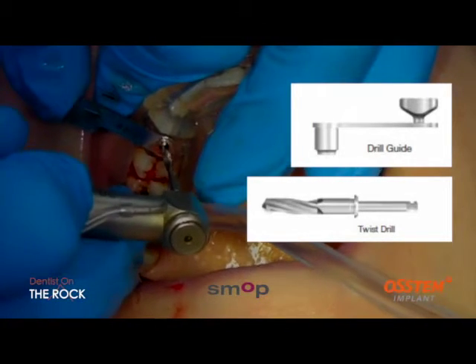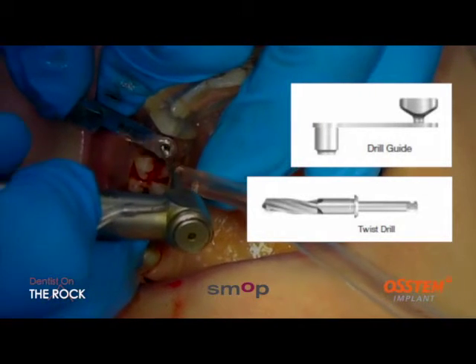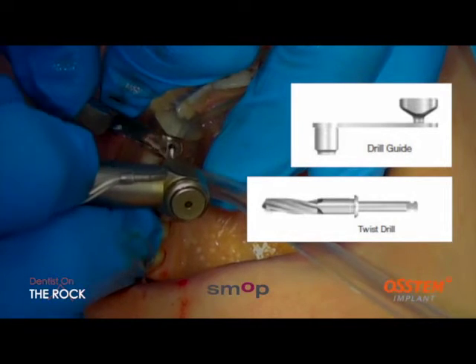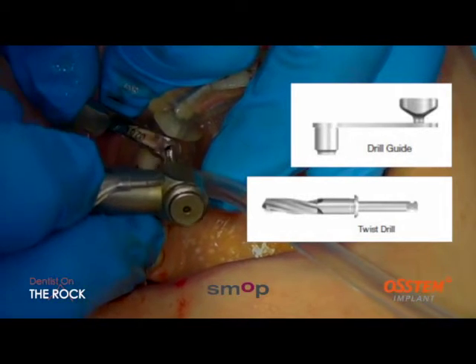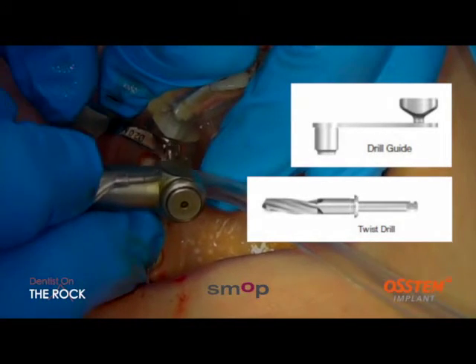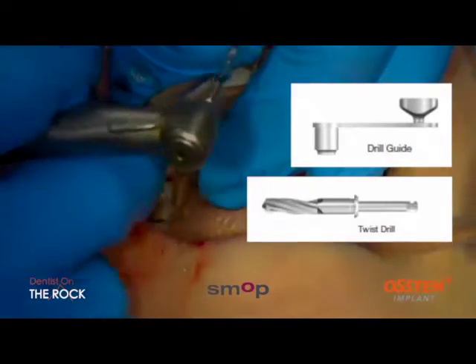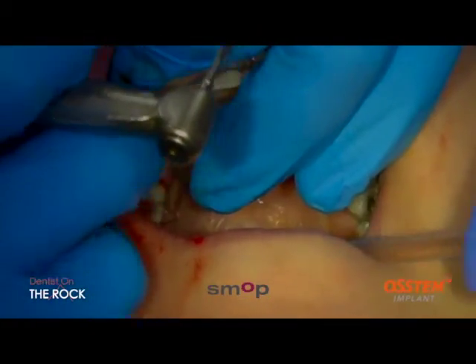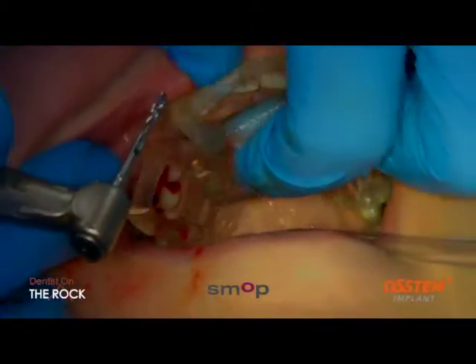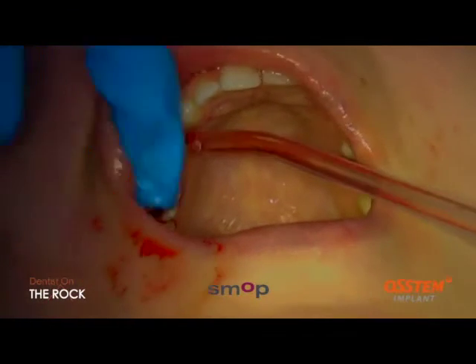But I want to try and make sure that there isn't any vibration to decrease accuracy. And again, the key is very tight. There's only a little bit of tolerance there. And that should fit perfectly down that path that I've made. And you can see I'm pumping all the time. When that water's flowing there. Again, you can see that the key takes a little bit of effort to pop out of that. You okay, Deborah?